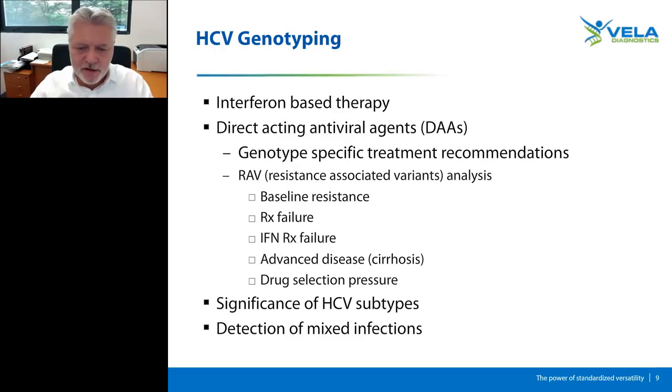The question is, is there a clinical significance? And we do not know this. Only with the new technologies can we now take a closer look at it. And last but not least, importantly, in many patients we see mixed infections which are not readily detectable by line probe assays. That is important because mixed infections may change the regimen for treatment.